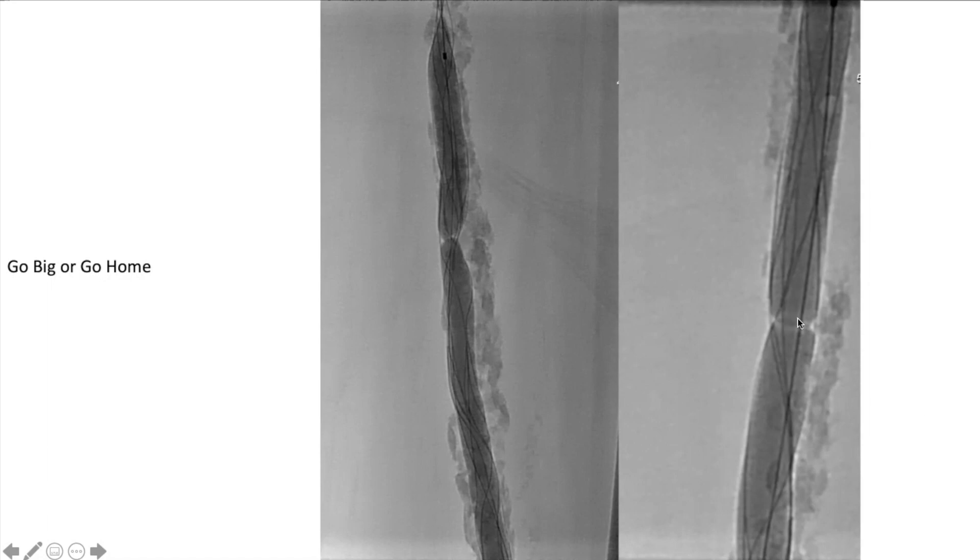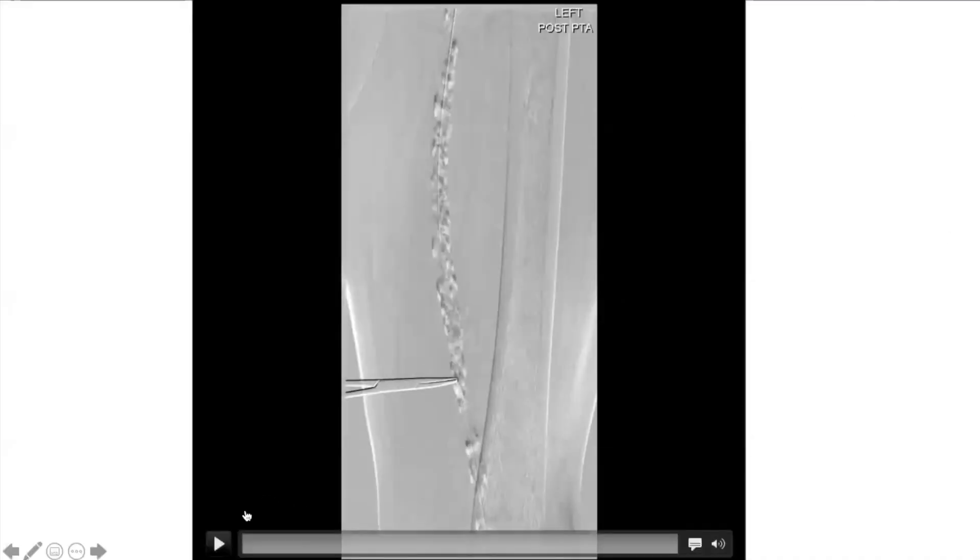One thing to know about AngioSculpts: they're a little finicky going through the sheath depending on which sheath you're using. They can get little kinks or areas of the balloon that cause a false waist. To distinguish: if you reposition the balloon and see the waist at a different location, it's in the balloon itself — not a true lesion waist. This happens because you have a long nitinol cage wrapped up going through the sheath.